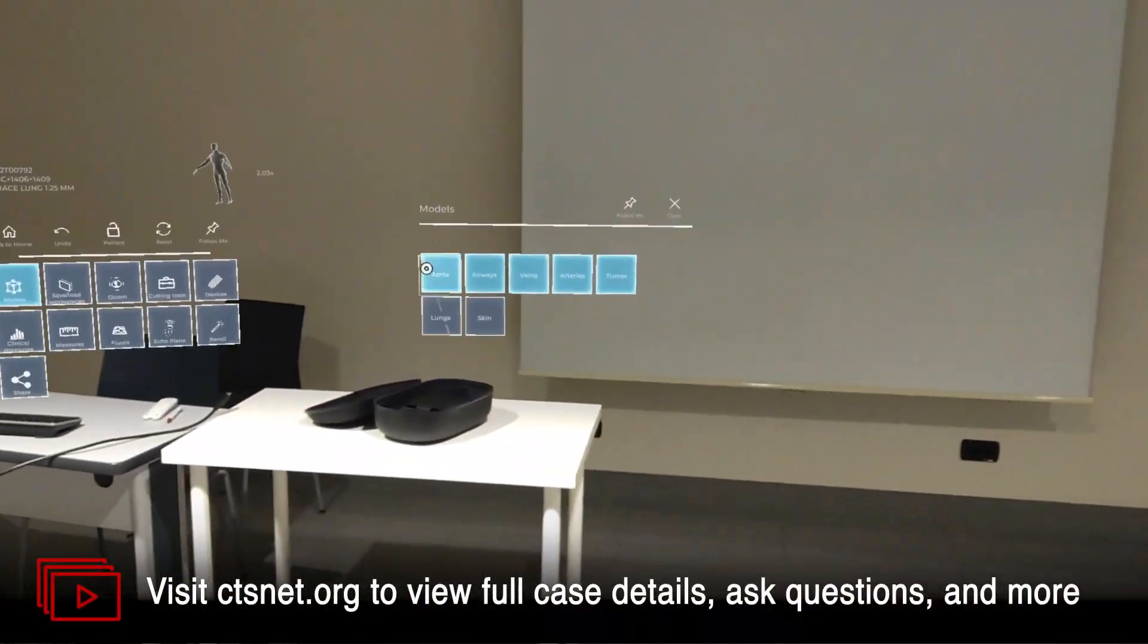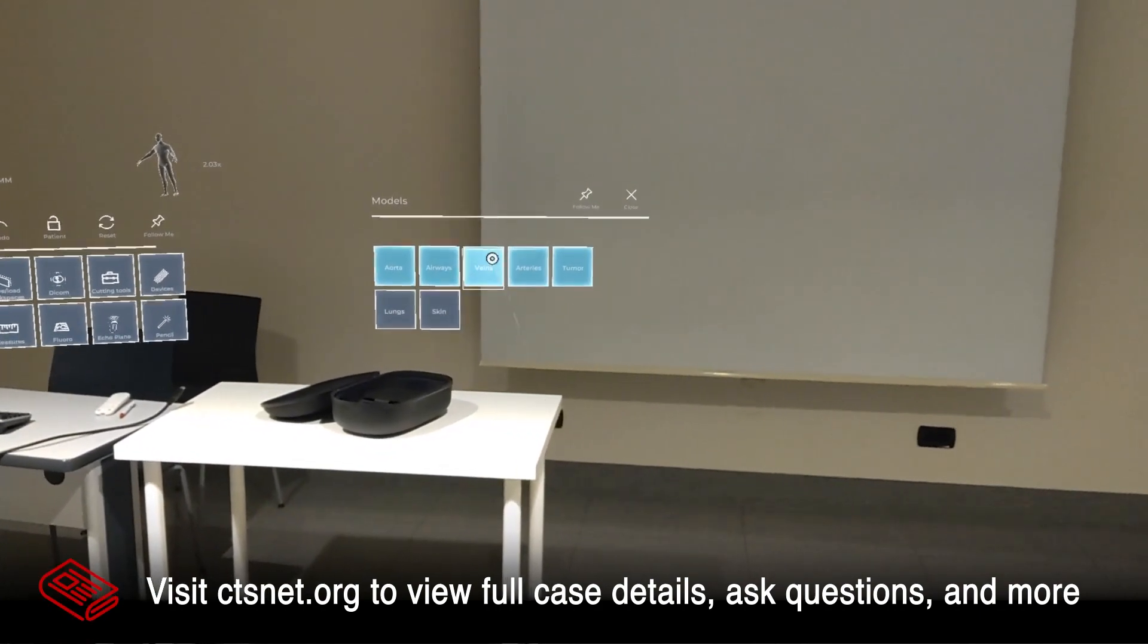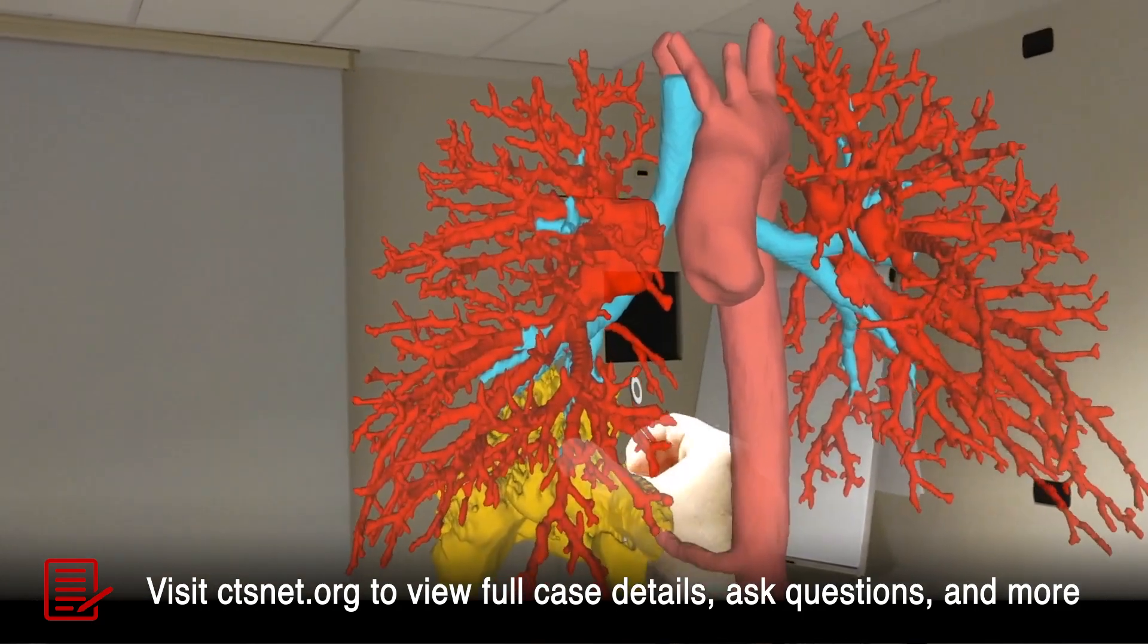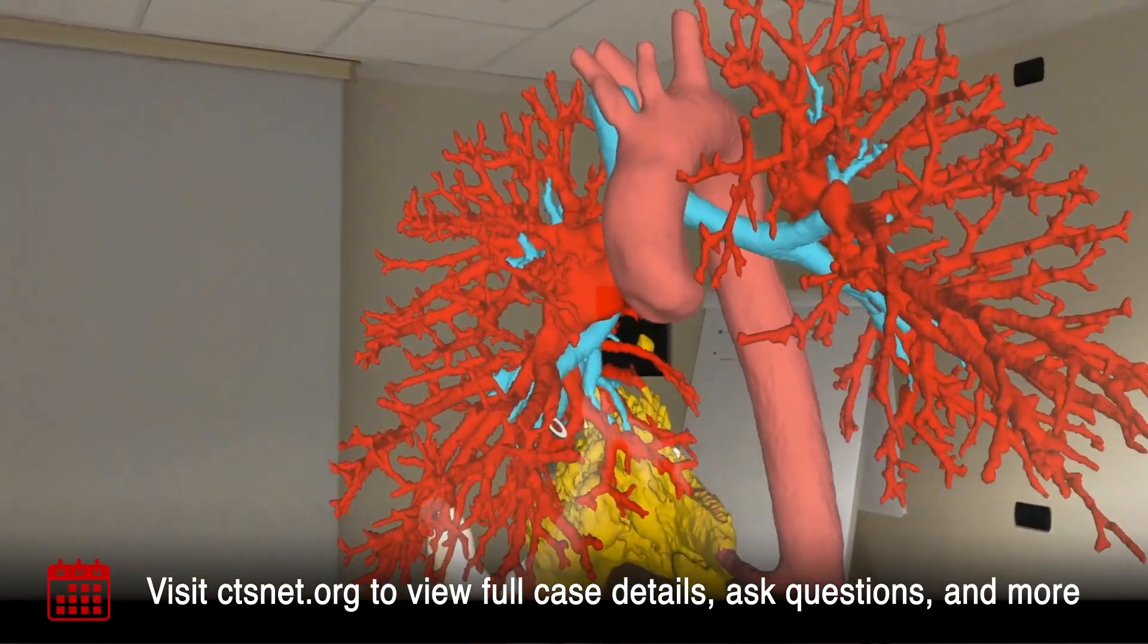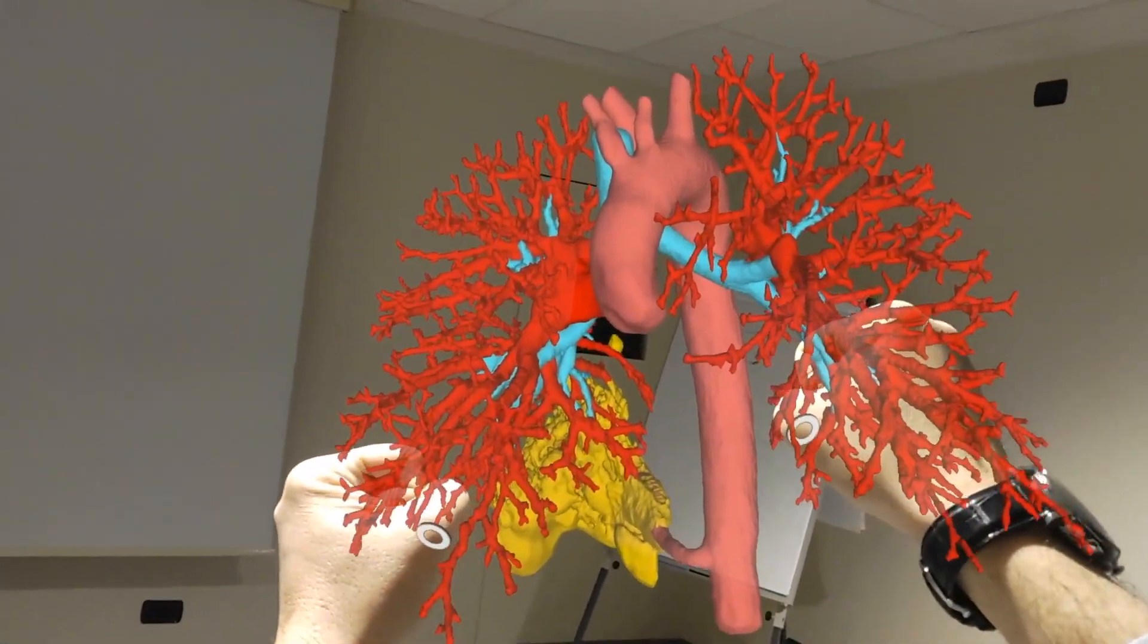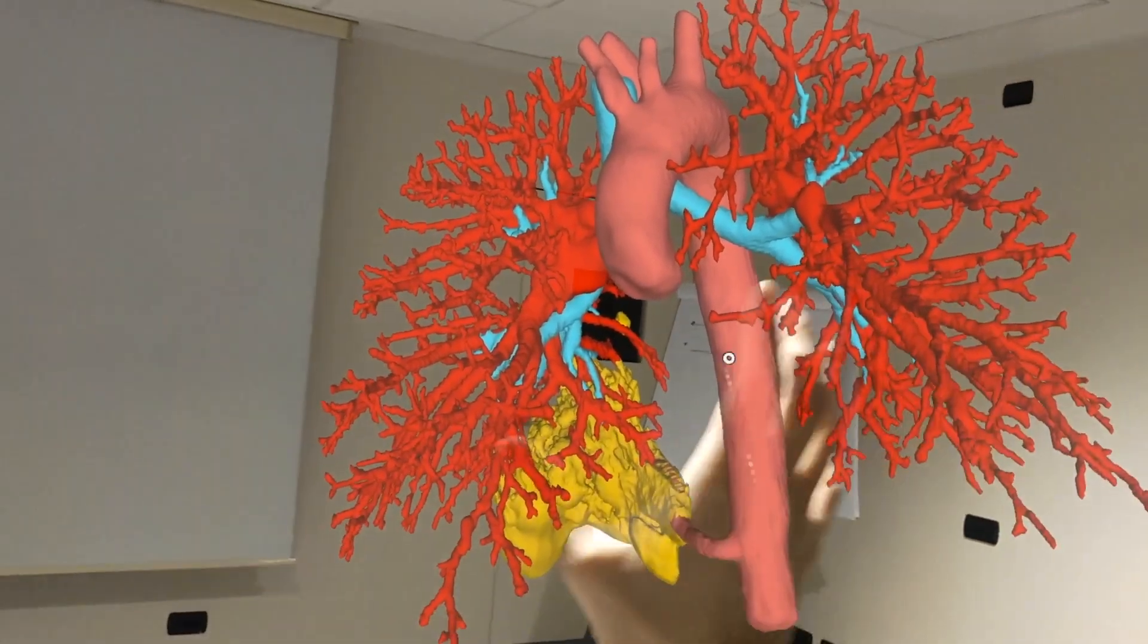Chest computed tomography and holographic reconstruction disclosed a transdiaphragmatic feeding artery from the abdominal aorta entering the pulmonary lesion, thus suggesting an intralobar pulmonary sequestration.